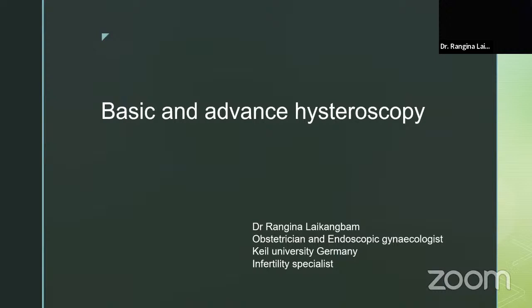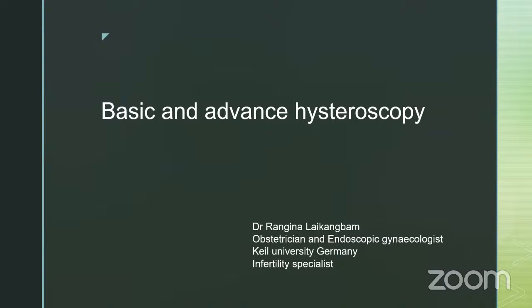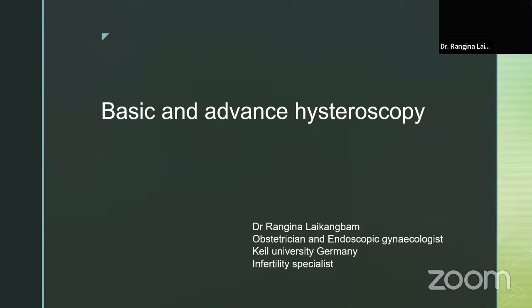Okay. Ma'am, then there is the second question. What is the recovery time for a hysteroscopy procedure? It depends on the case. Like if you are doing just a uterine septum, I think even Dr. Ritu will agree that nowadays there were days when we used to put IUDs after a uterine septum resection.